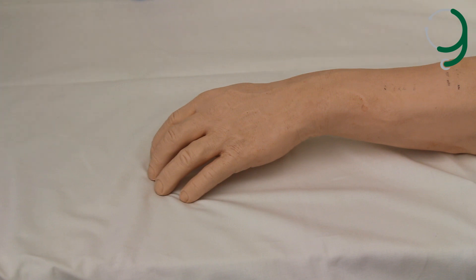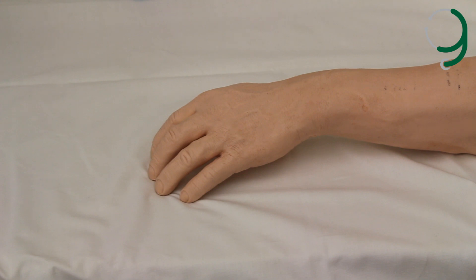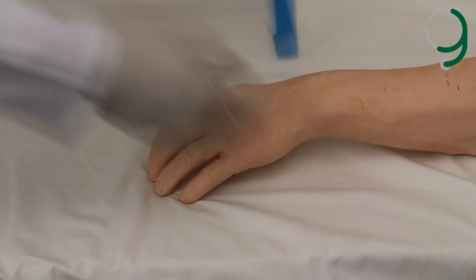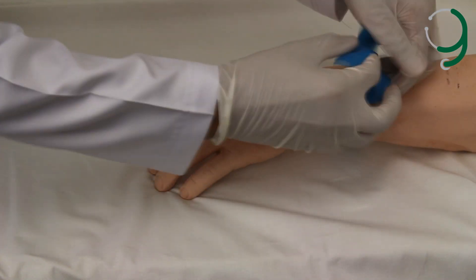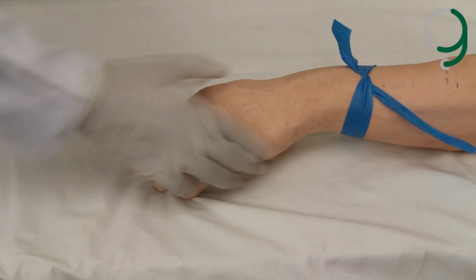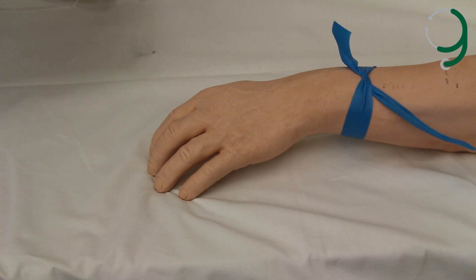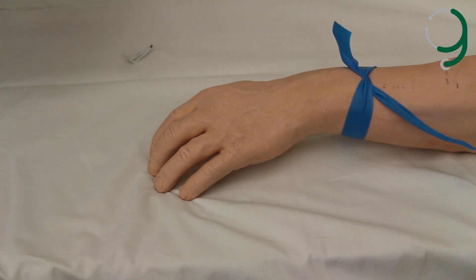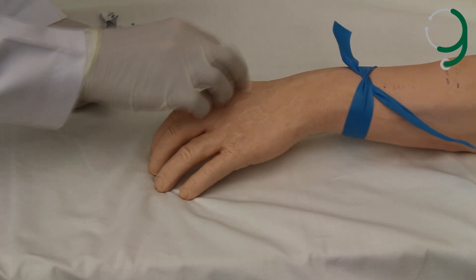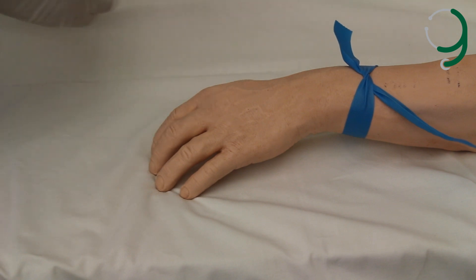First we will do IV cannulation. The first thing you've got to do is look for the appropriate vein. After you choose the vein, you apply the tourniquet proximal to the vein you've chosen. Then you tap the vein you chose and apply an alcohol swab. Allow the alcohol swab to dry.